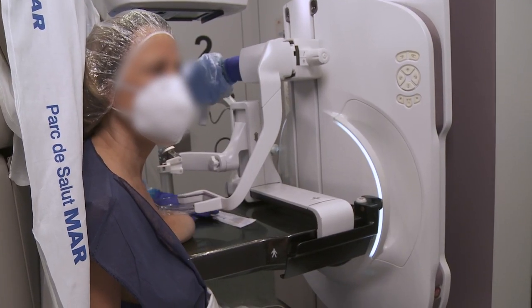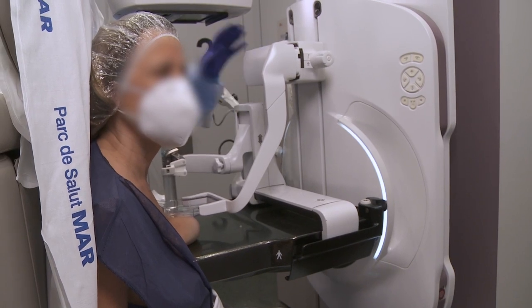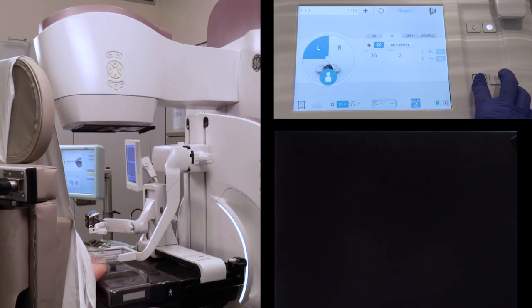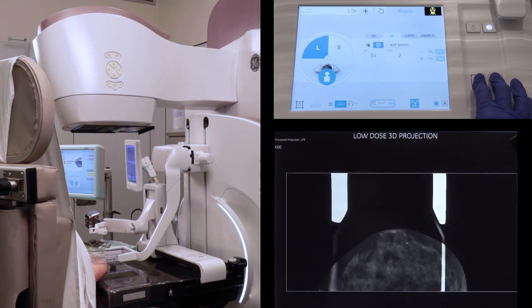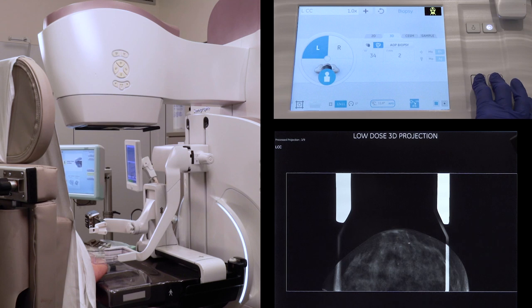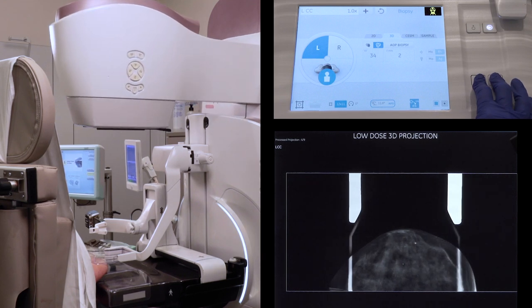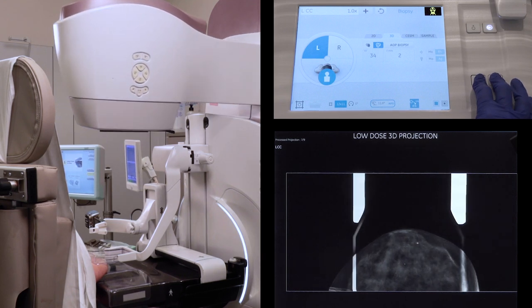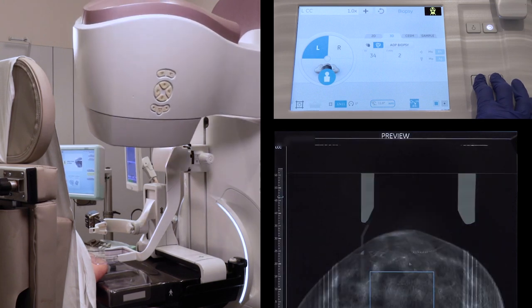The 3D biopsy exam starts. The X-ray console is set up to obtain a 3D Automatic Optimization of Parameters sequence. Exposures are performed, 3D projections displayed, followed by the Preview Tomo images.